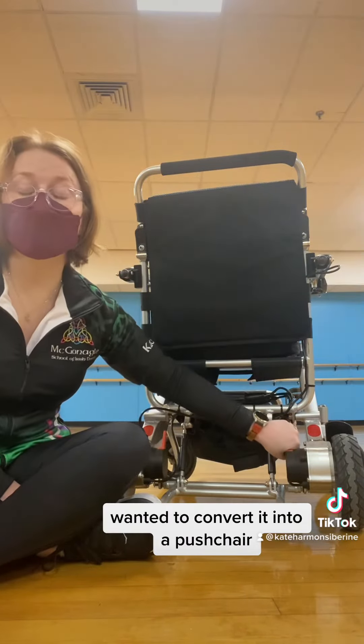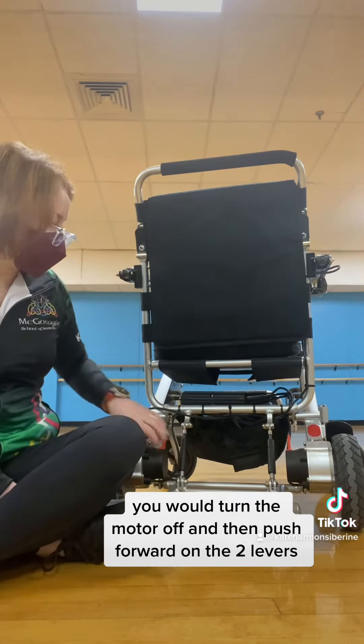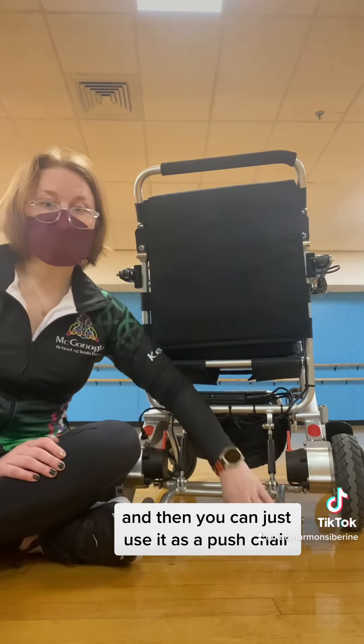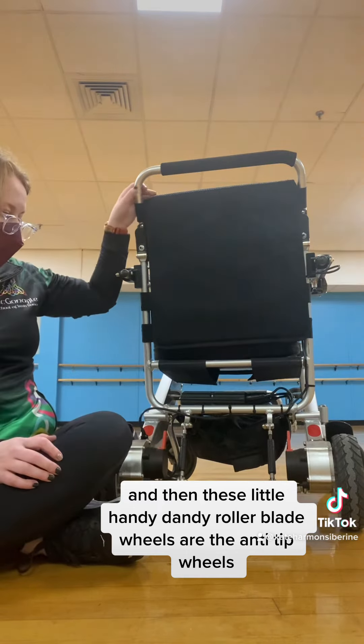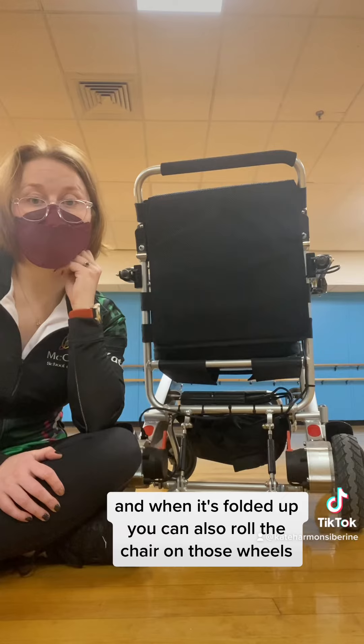If you wanted to convert it into a push chair, you would turn the motor off and then push forward on the two levers, and then you can just use it as a push chair. These little handy-dandy roller blade wheels are the anti-tip wheels, which are great for going down hills. And when it's folded up, you can also roll the chair on those wheels.